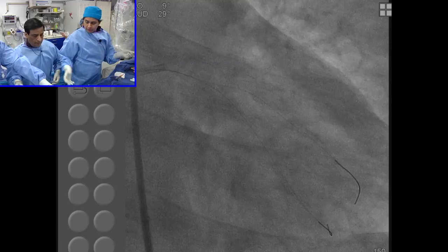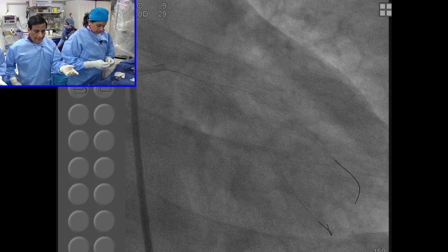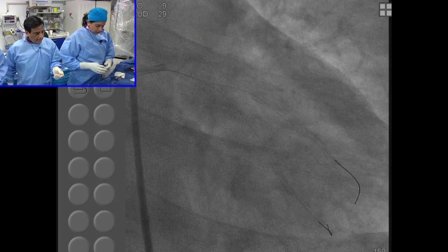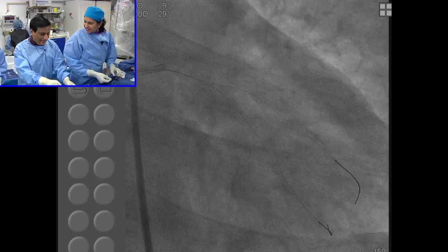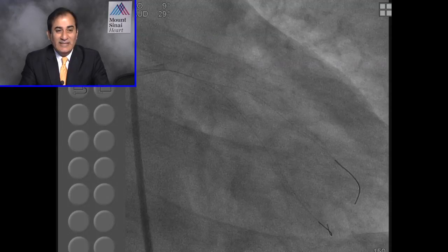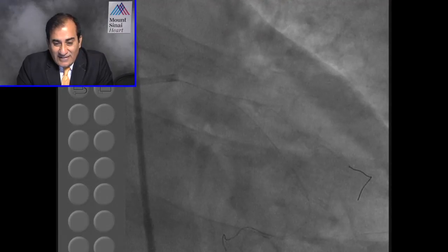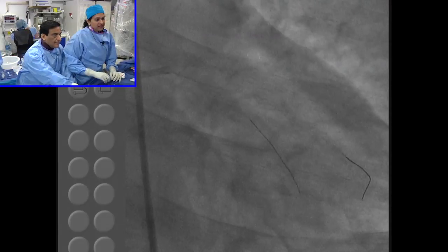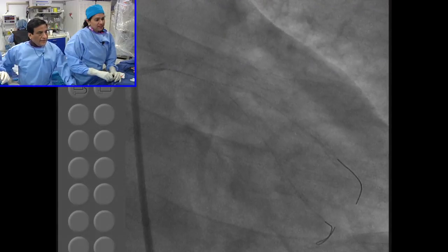So here is the gaining popularity of the chocolate balloon. People have found it very interesting, as far as Santiago, Dominican Republic, Dr. Aramis Gomez. Bienvenidos. I don't know whether it was your comments or how the balloon interacted, but the balloon there tracked very nicely.